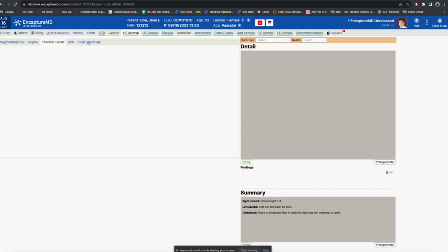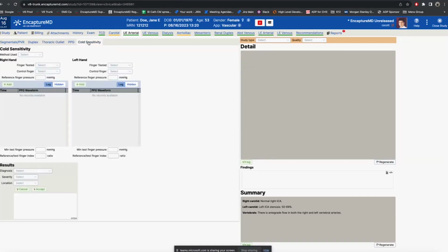If a patient puts their hand in a refrigerator in July and their fingers turn white, that's much more common in certain genders and also in patients who smoke. I want to know that, and I can actually test for this in the lab by making one of the fingers or the whole hand cold and testing that. This allows me to do those sorts of reports.